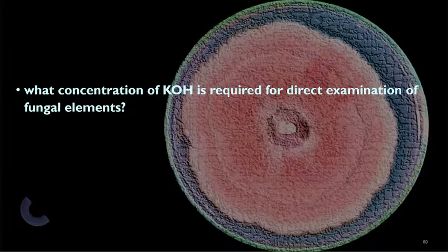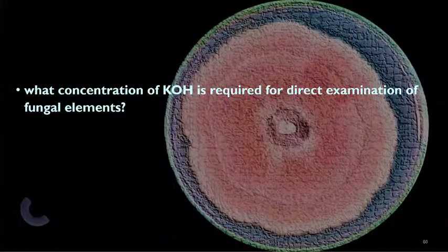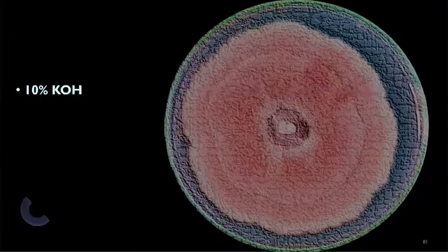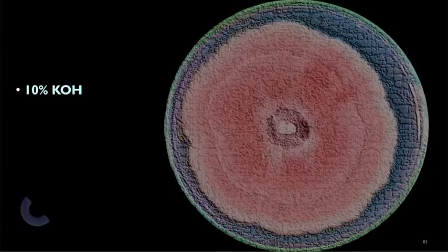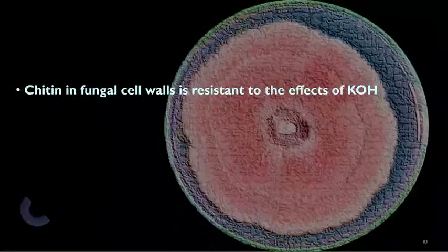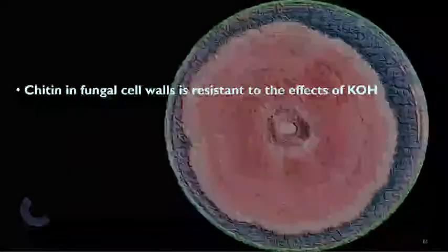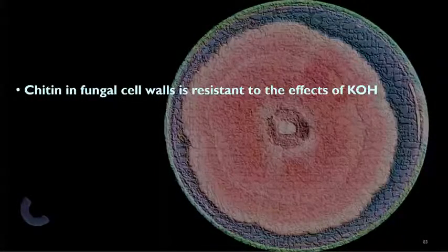Basta, more or less, kung kayo ay nahihirapan talaga sa mycoviro, in your exams, I want you to focus on laboratory techniques because these are the bulk of your questions can come from these things. Huwag nyo kakalimutan na it destroys or dissolves the keratinized portion of your sample. Kaya 10% KOH ang ginagamit natin. Chitin and fungal cell walls are resistant to the effects of KOH, but skin cells or your nails or your hair will dissolve from KOH.